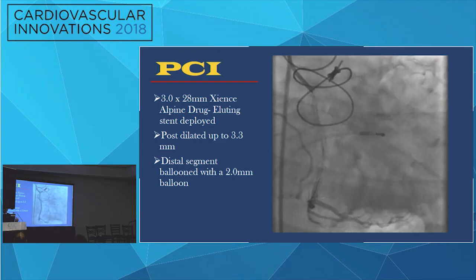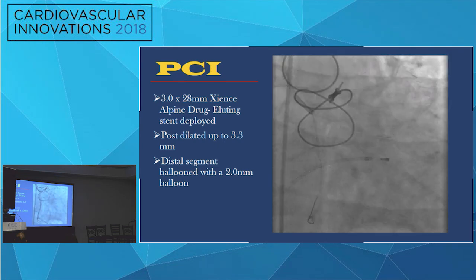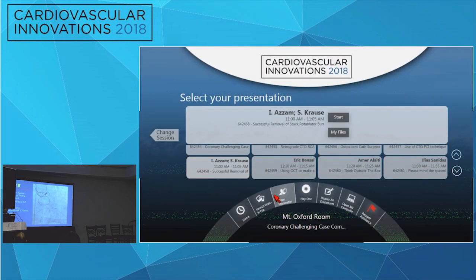distally and proximally and deployed a 3.0 x 28 stent in the proximal to mid circumflex, post-dilated distally with a 2.0, and got a good result.